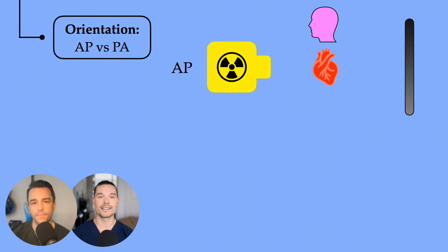The last thing that we want to talk about is the scout. The scout view is essentially the x-ray that is taken with all of your CT scans. It is quite helpful sometimes when you're trying to orient yourself and see where you're at on your CT. The example that we're going to do for you is a CT brain. The x-ray version of the skull is there with the yellow line, and the plane that we're using for this particular image is a sagittal view of that CT brain.